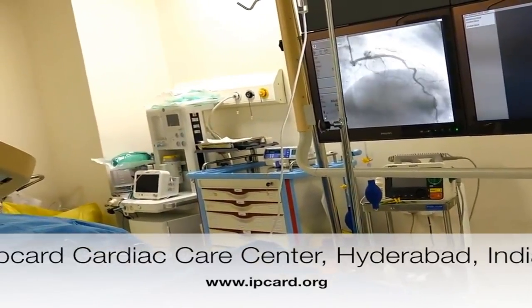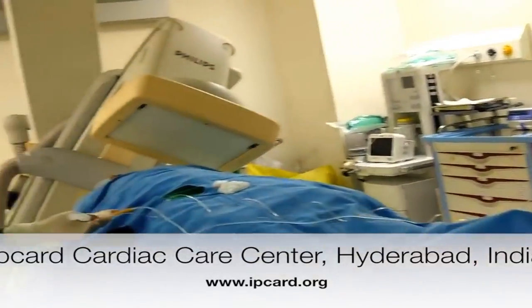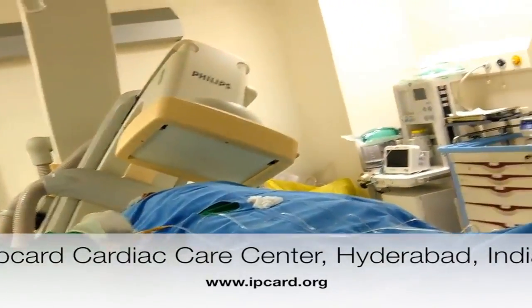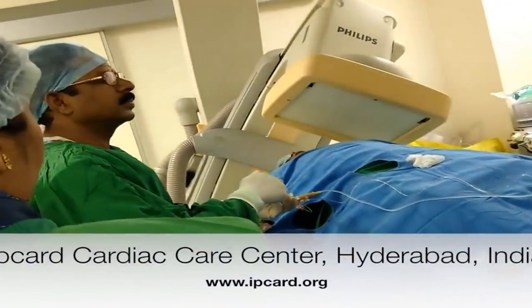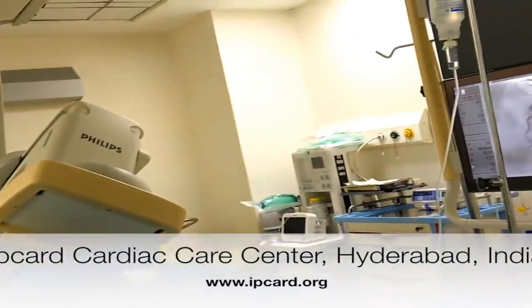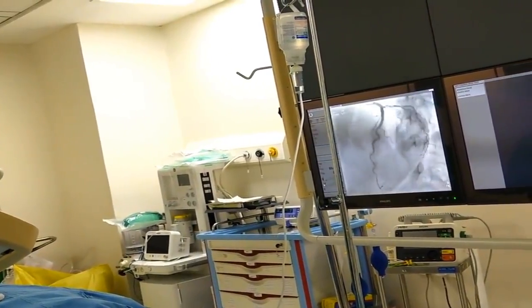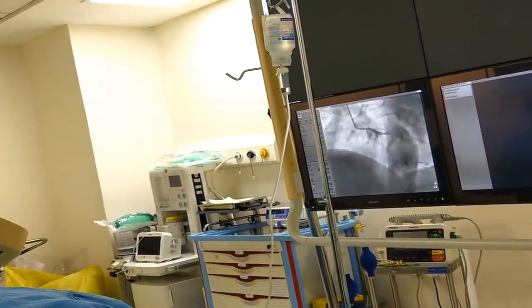Meanwhile, we ask the patient about any discomfort. If there is discomfort, we immediately try to relieve it during the procedure. Interacting with the patient this way is helpful to reassure them and address any complaints.